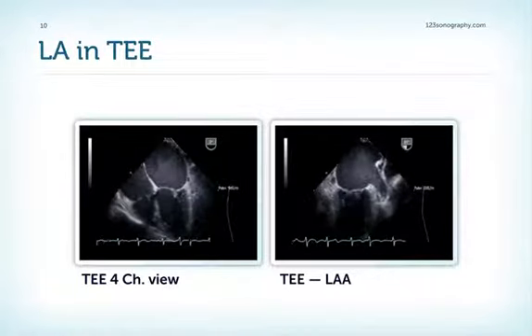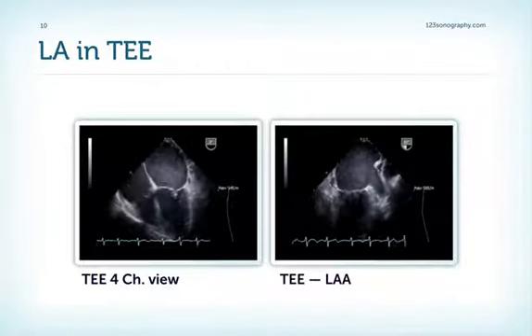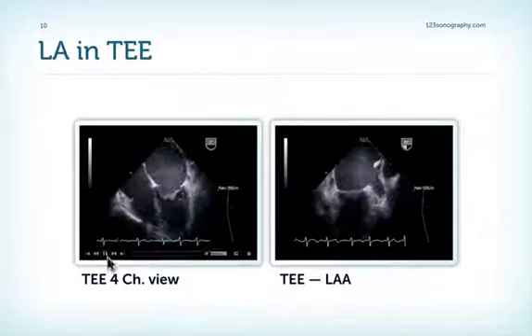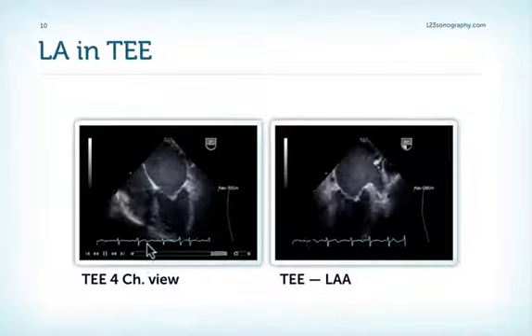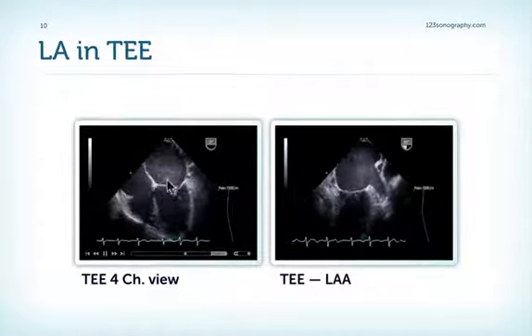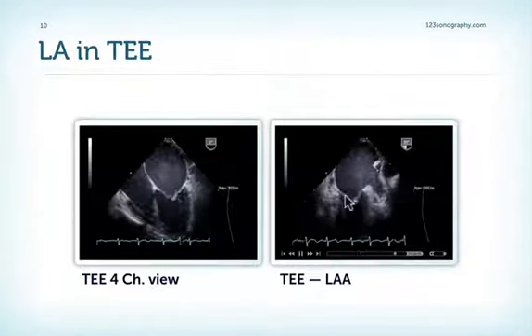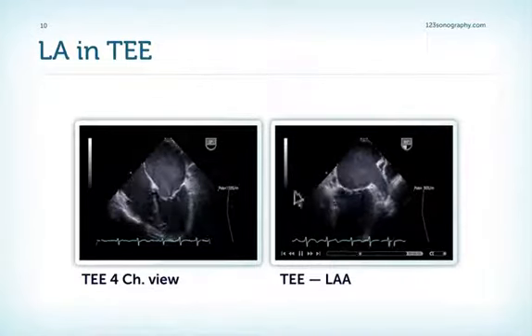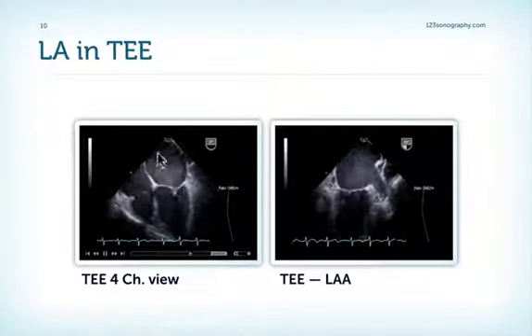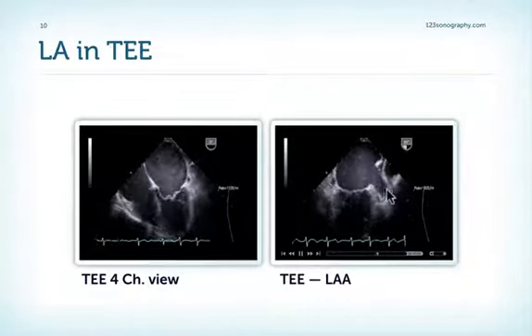Transesophageal echocardiography is particularly valuable to look at the left atrium. These are two examples showing how good the image quality can be with transesophageal echo — we can even see flow within the left atrium in this patient with severe mitral stenosis, where we have slow flow phenomena in the left atrium and in particular in the left atrial appendage.